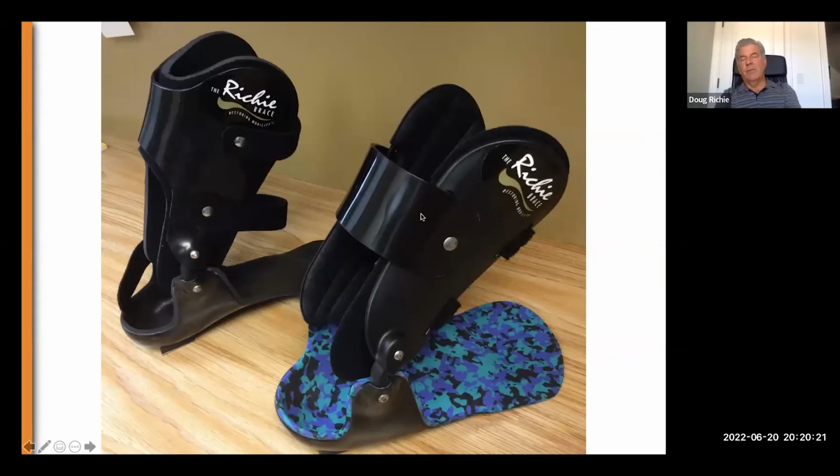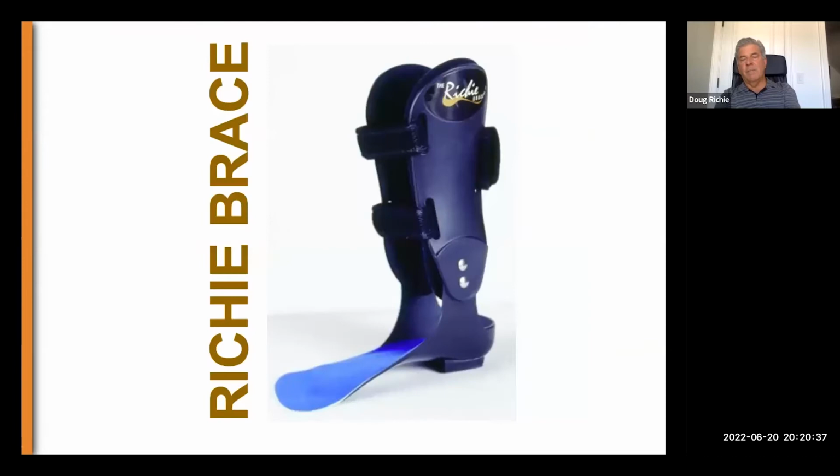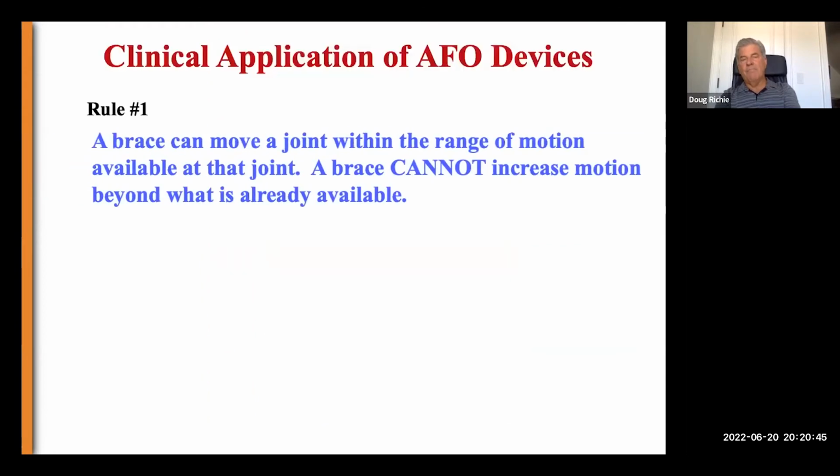We don't like doing it with plastic, as I showed you in the previous slides, but upon request of the practitioner, we can add this carbon graphite ring posteriorly to provide some posterior stability. In my experience, that's rarely needed. So this is the restricted hinge Richie brace that has very little sagittal plane motion.